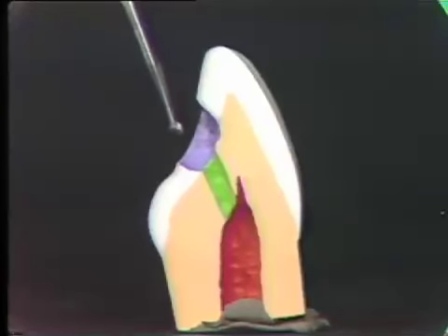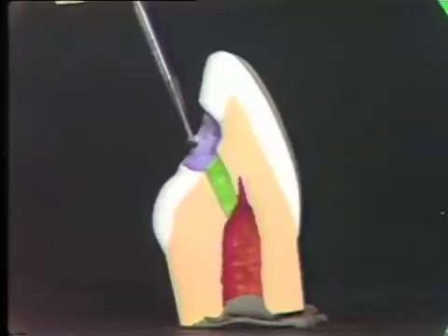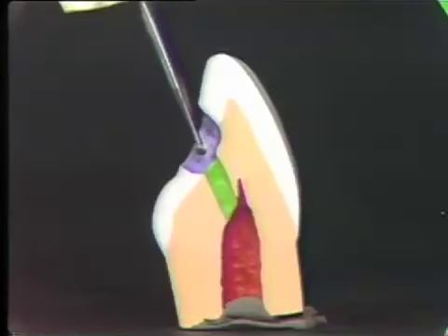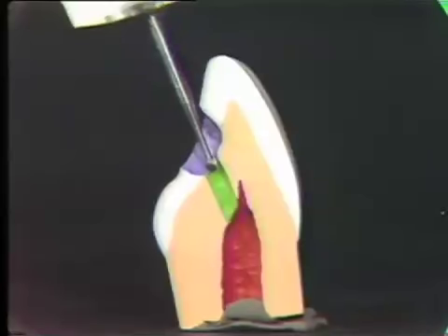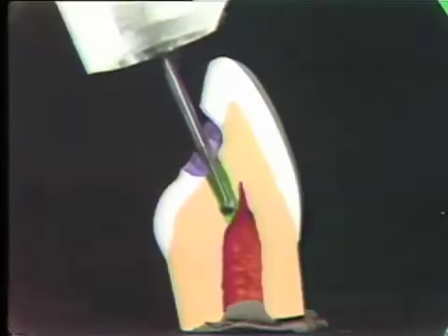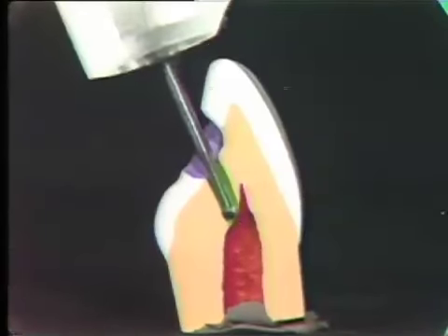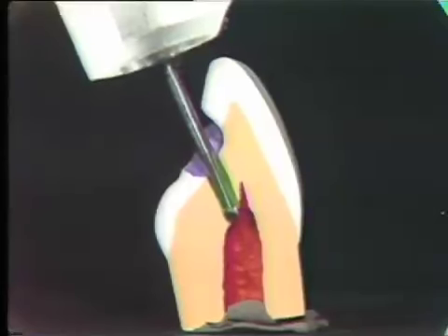You know the pulp is going to be in the center of the tooth, so you want to cut right down the long axis of the tooth. And in one straight shot, you connect the original outline form with the pulp chamber. You'll know when you get to the pulp chamber when you feel the burr kind of drop into the pulp chamber, as there's a reduction of cutting pressure on the burr.